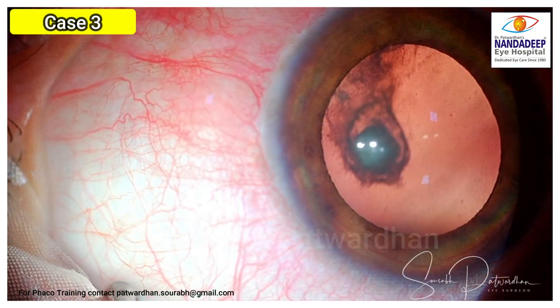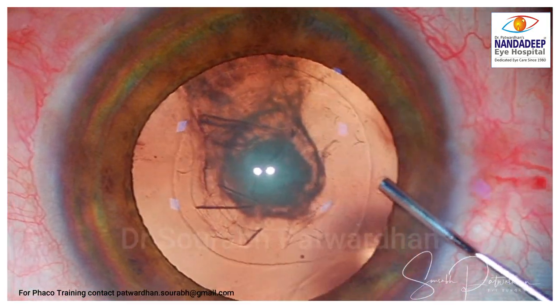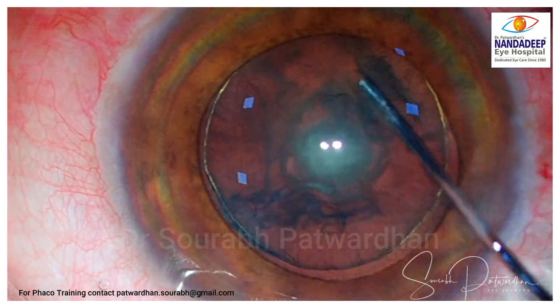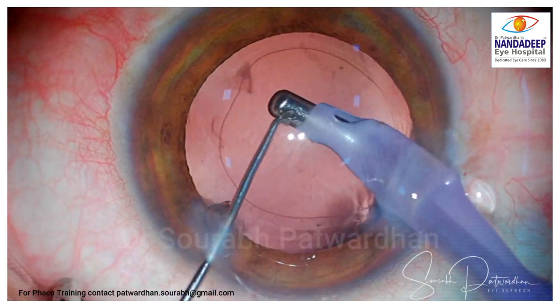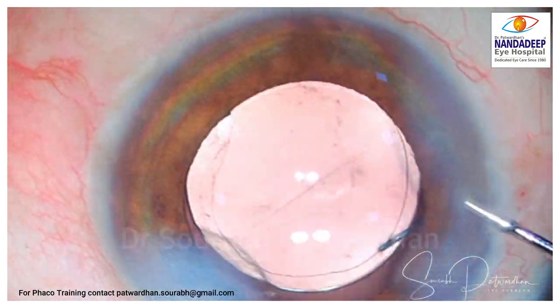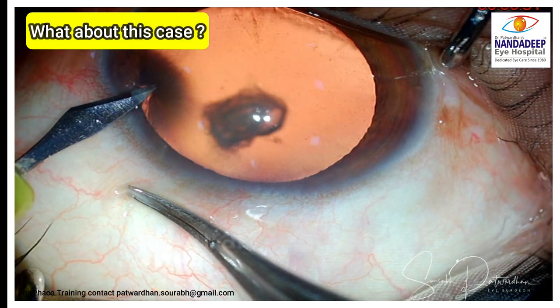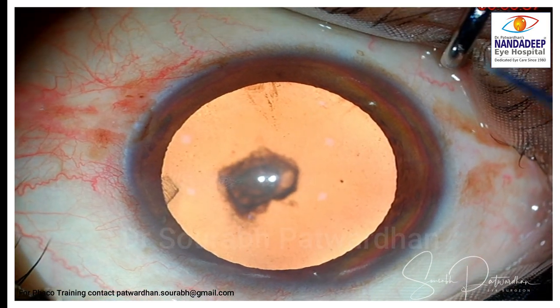The third case had a few signs of posterior polar cataract — sharper margins — though there was a component with fuzzy margins. I presumed this as a posterior polar cataract, thus avoided hydro dissection and did all the steps classically described for posterior polar cataract. It went uneventful, and the IOL was placed in the bag. So I presume that the third case was the posterior polar cataract, though there was a PC opening in the second case which probably was due to a minor manual error.